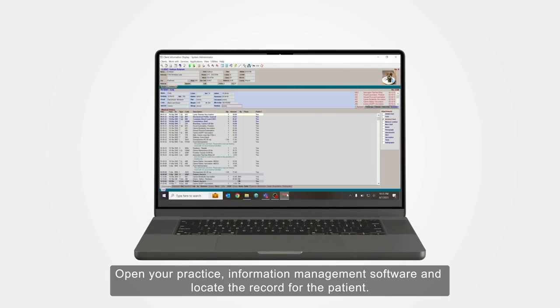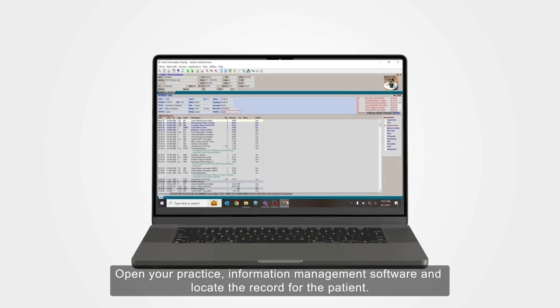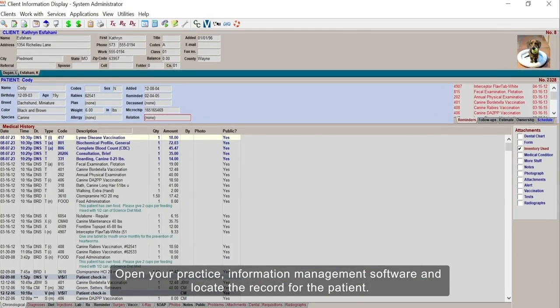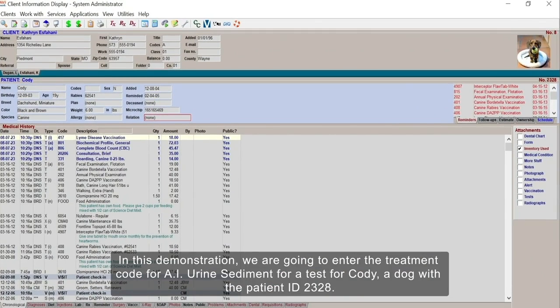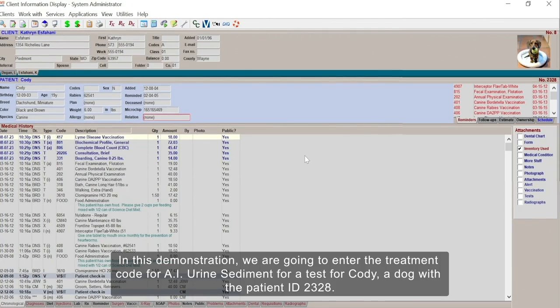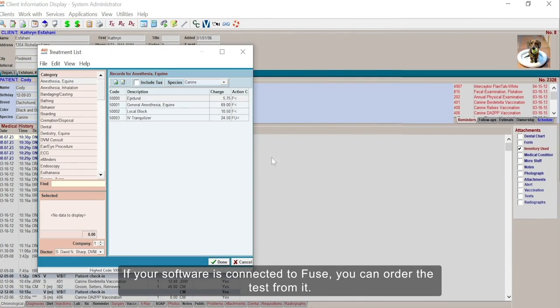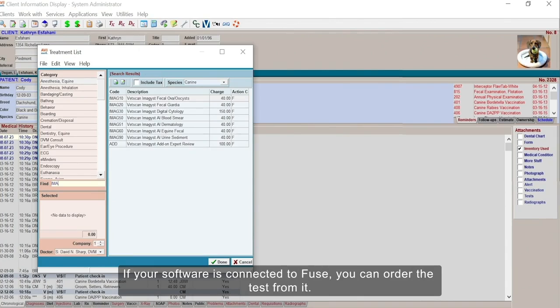Open your practice information management software and locate the record for the patient. In this demonstration, we are going to enter the treatment code for AI urine sediment for a test for Cody, a dog with the patient ID 2328. If your software is connected to Fuse, you can order the test from it.